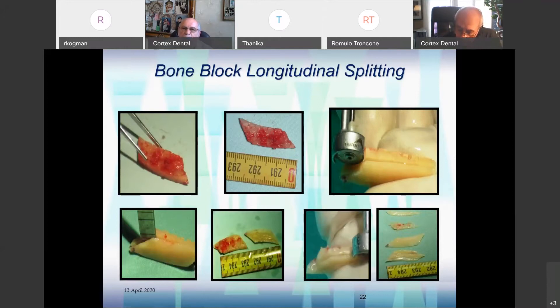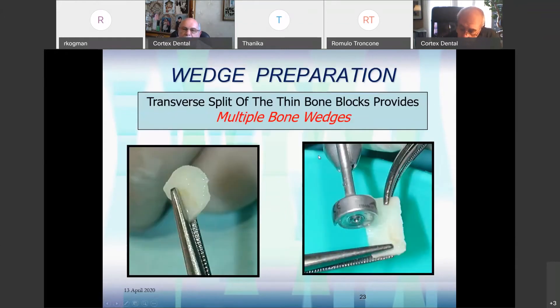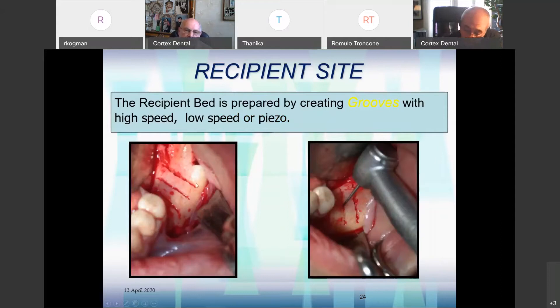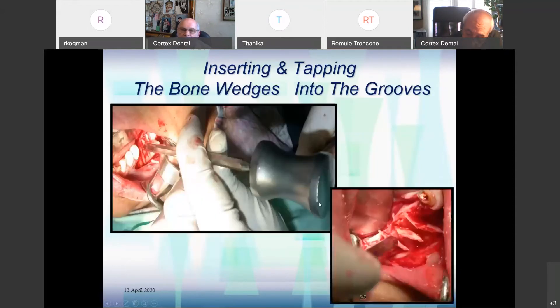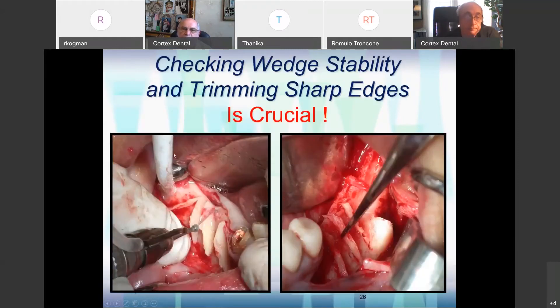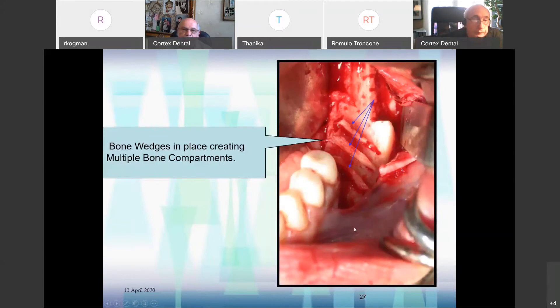We prepare the wedge and smooth it. Then on the recipient site we make grooves — we can use high speed, low speed, or piezo. Then we tap in the wedges and make sure they are fixed. It's really important to trim and round the edges so they won't tear the soft tissue. The bone wedges are placed, creating multiple bone compartments. They keep the membrane in place and keep the bone particles from shifting around.